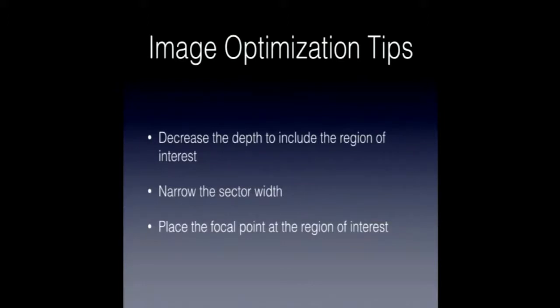And then there's also another knob for focus, and you can see it on the right-hand side of the screen often. There'll be a little slider that moves up with the focus, and you can slide the focus just to where you want it. And I'll get to that in a moment, but that's obviously important for regional anesthesia.